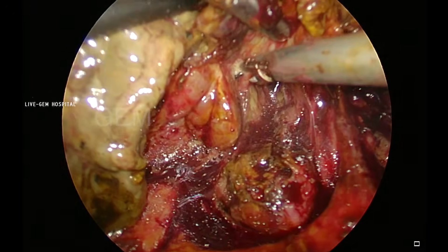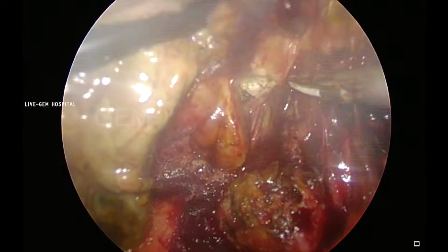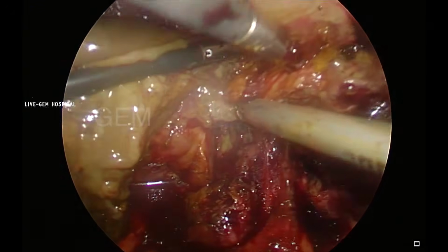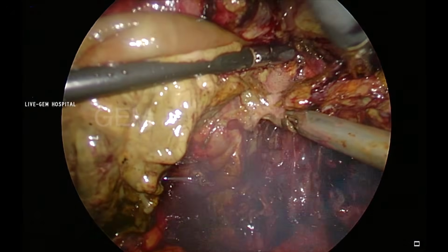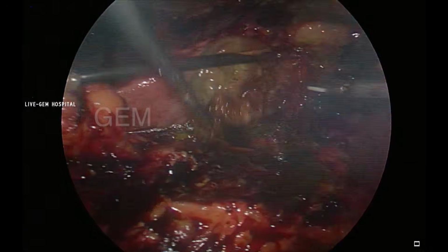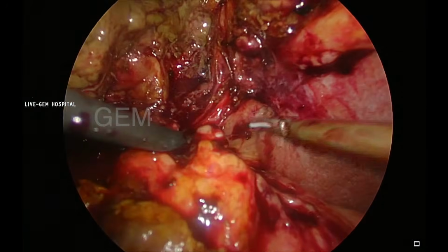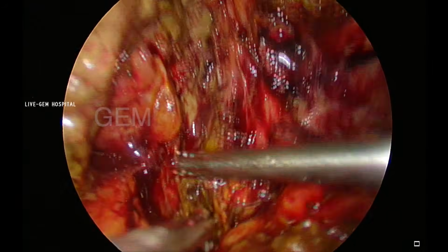So what I did, I excised all the excess infundibulum. Only a small pouch of infundibulum is there, and the mucosectomy is also done. Even in the body and fundus of the gallbladder, the mucosa was removed. So type 1 modification and type 2 modification are already done.